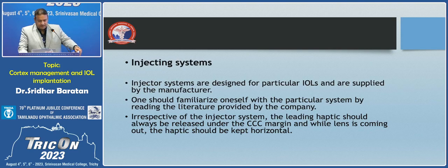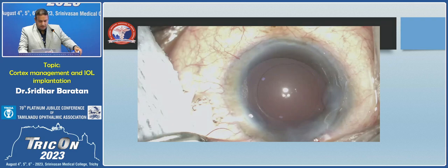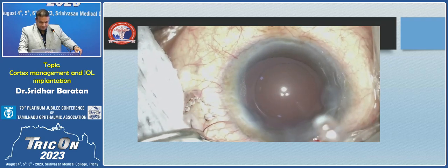Irrespective of the injector system, the leading haptic should always be released under the capsulorhexis margin, and while the lens is coming out, the haptic should be kept horizontal. The advantages are a smaller incision, disposable cartridges, and a trailing haptic that may be inserted without coming in contact with the external ocular tissues. Let's go in with the videos.